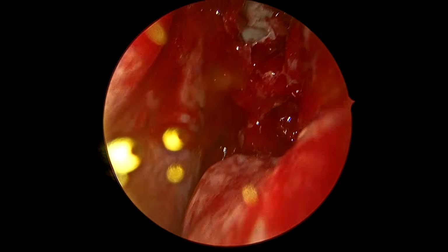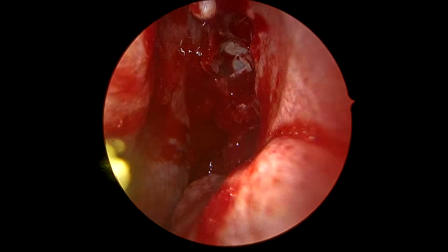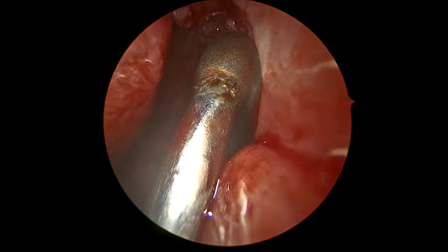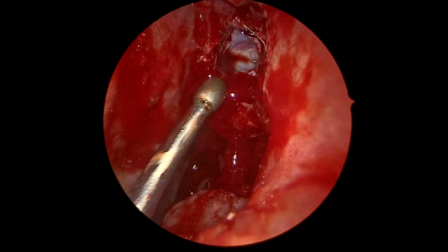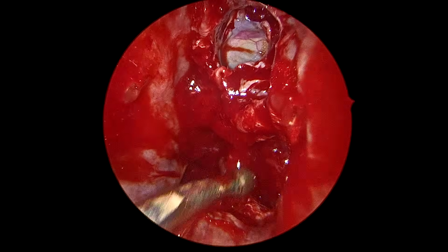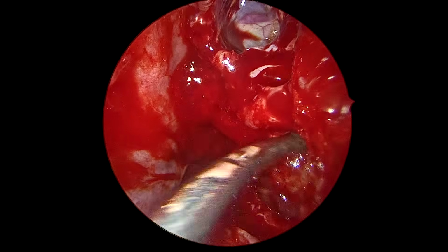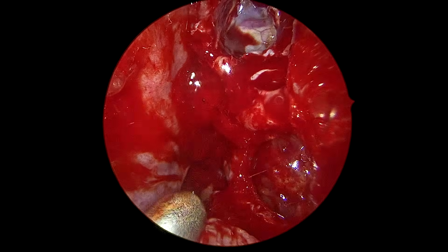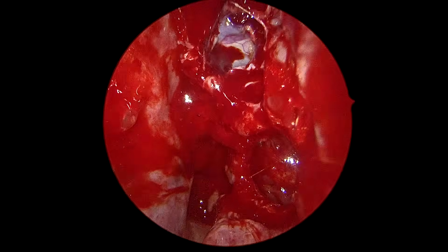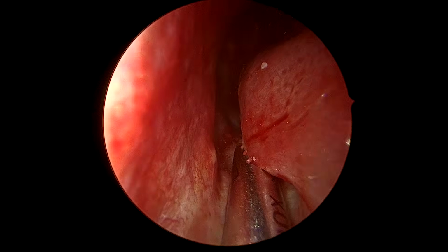You can see this part is pretty much clear. No evidence of any mass or any suspicious lesion posterior to the bulla. So I will stop. I will not go more posteriorly because I can see this part is normal. The inside of the maxillary sinus also looks pretty much normal. This will be my limit of dissection.